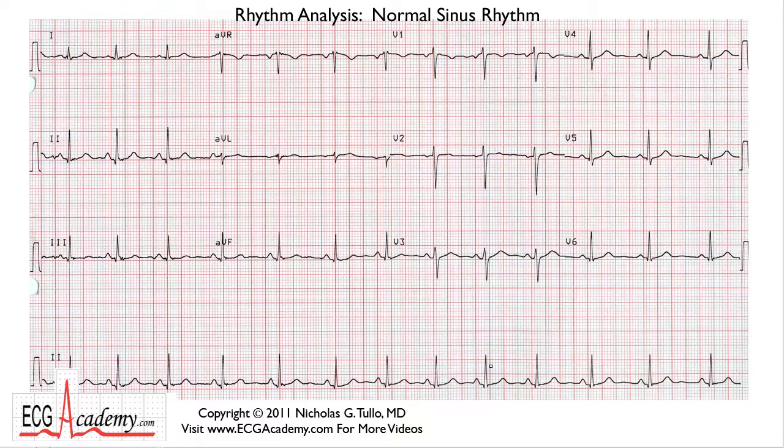And in the cardiograms that I see in the hospital that are misread, it's almost always the rhythm that's misread, not so much diagnosing an old inferior infarction or anything like that. The rhythm is really the hardest part. So we're going to start with rhythm analysis.